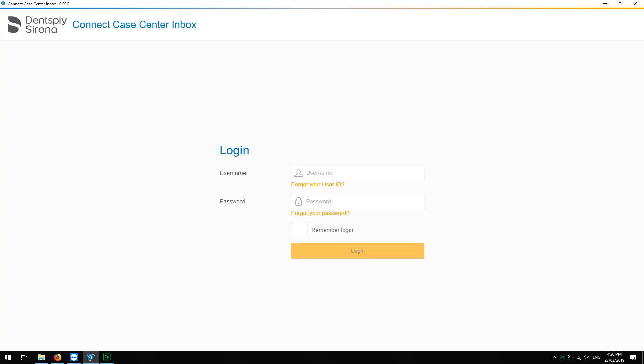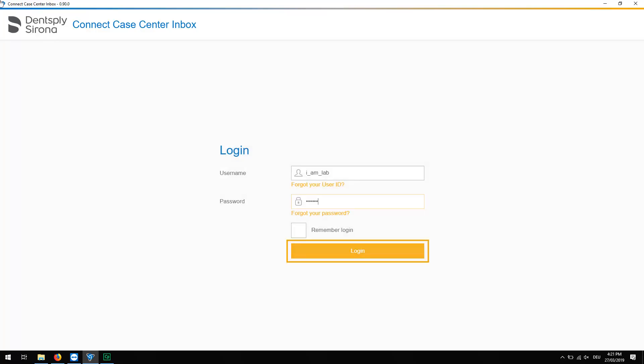After you have set up a ConnectCase Center account and the inbox is installed, the application opens automatically. On the login page, we enter the same username and password that we have used for our ConnectCase Center account, then click Login.